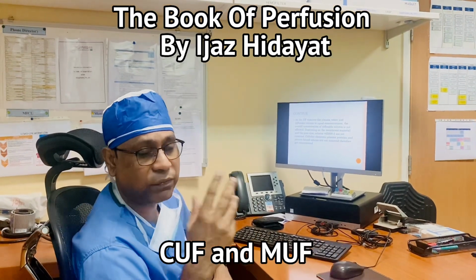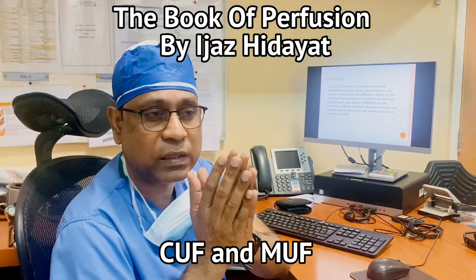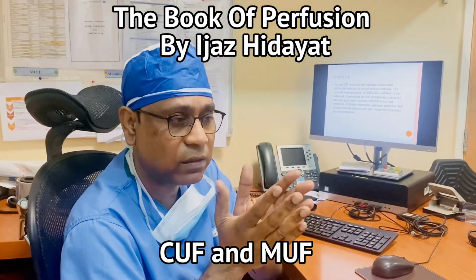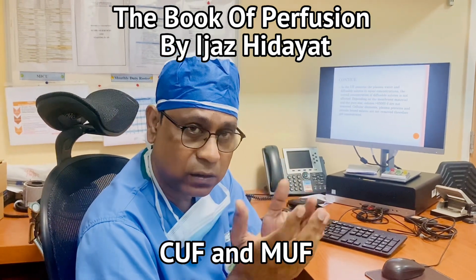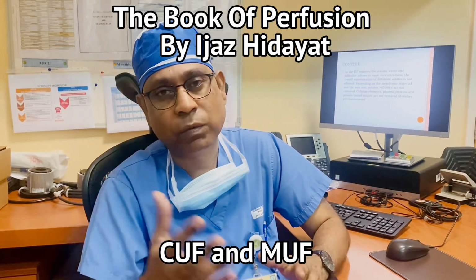During ultrafiltration, we remove the plasma water, which helps us to increase the viscosity of the blood, which decreases the dilution, and we can maintain the blood hemoglobin during the bypass.